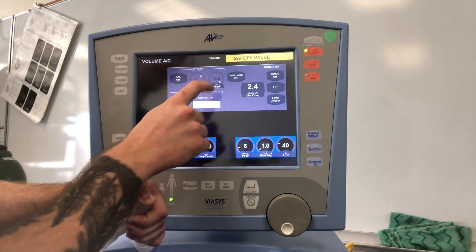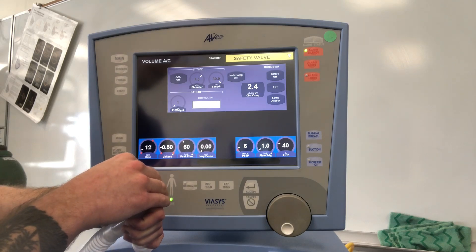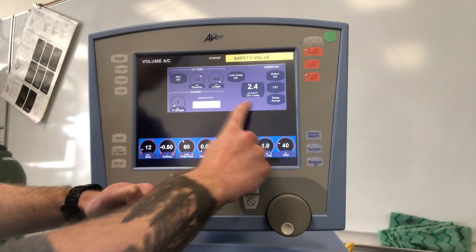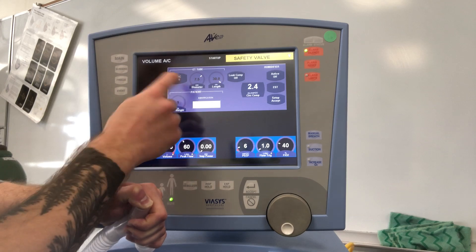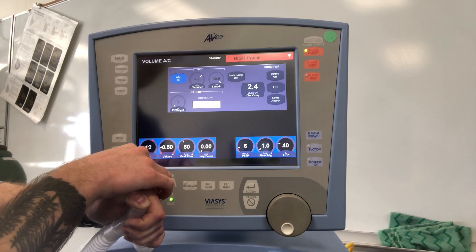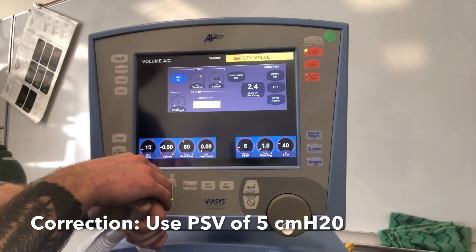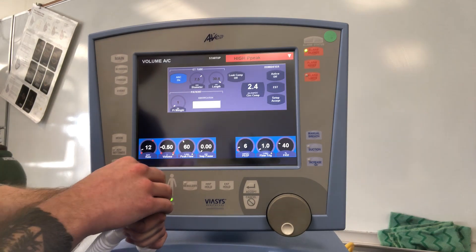After the EST, we have the ability to turn on leak compensation — it's either on or off. Leak compensation only corrects for baseline leaks in the endotracheal tube around the cuff or around the non-invasive mask; it's only to maintain PEEP and is not activated during the breath. Here's our displayed circuit compliance. We can use AAC, also known as ATC — it's not as strong as the Draeger V500. For SBTs, we recommend using a CPAP of five, as the AAC on the Avea isn't that fantastic but it is an option.